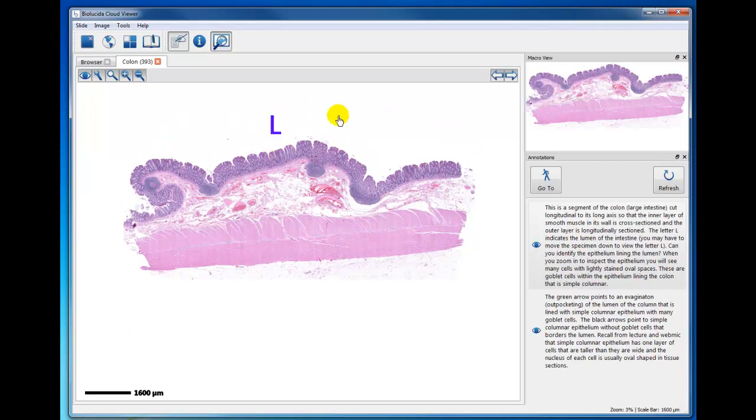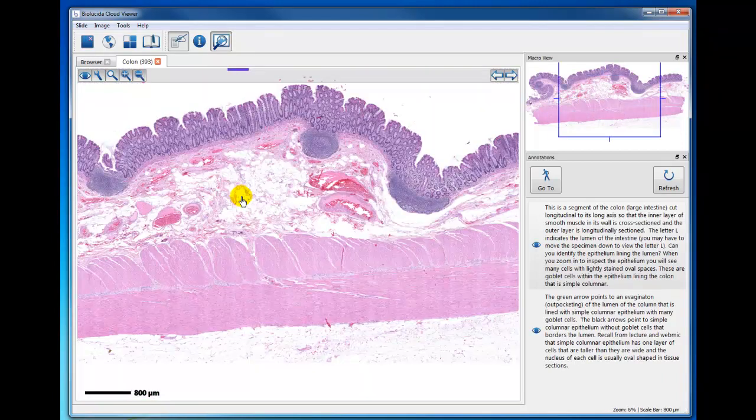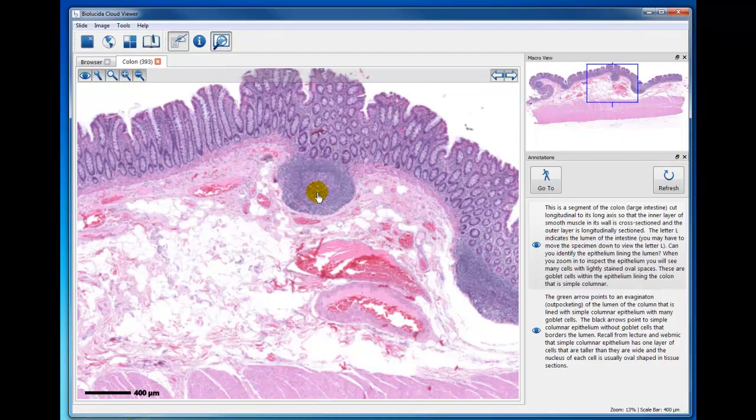This is the lumen side, and this is the covering of the intestine, and this reddish area here, that's the muscle that surrounds the wall of the intestine. And then you've got loose connective tissue with some adipose tissue, some blood vessels, even a lymphatic nodule here.